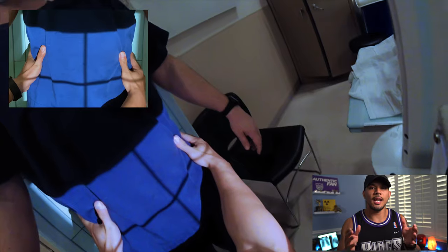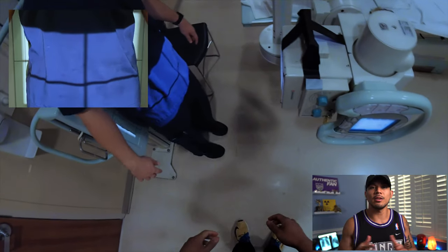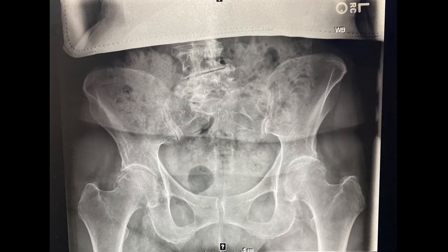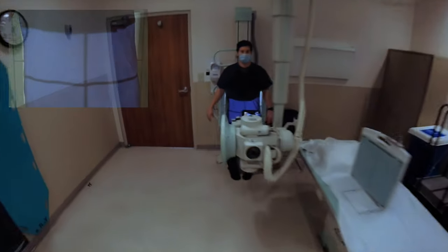therefore getting a repeat. I put my thumbs on each ASIS to split the difference, because a patient's figure at times can be deceiving. All right, hold still. All right.